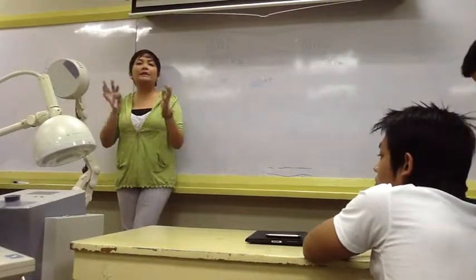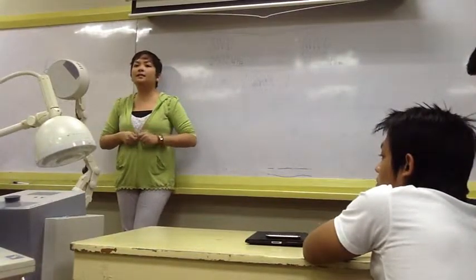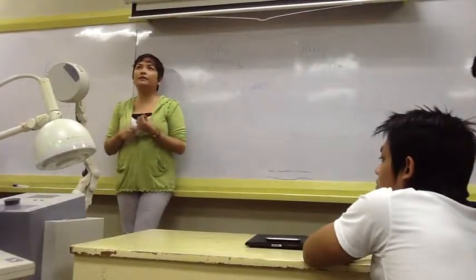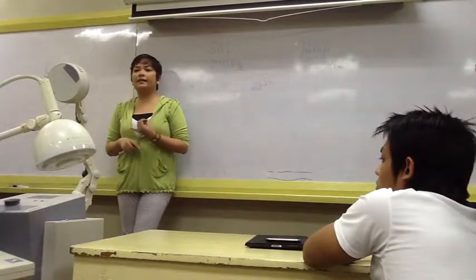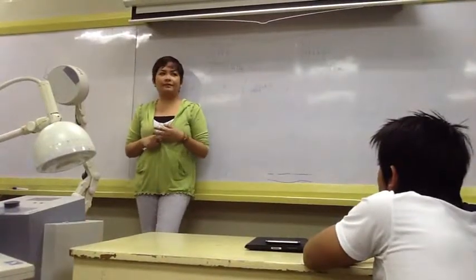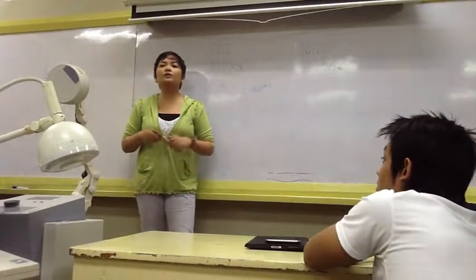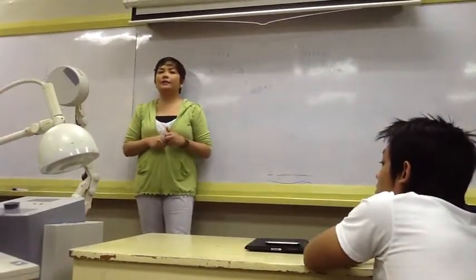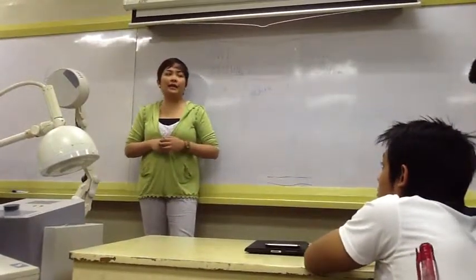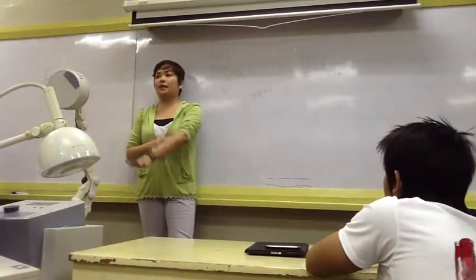But definitely, parehas lang sila ng effects. So ano ulit yung effects ng heating modalities natin? It promotes vasodilation. What are the benefits of vasodilation? Increased blood flow. What else? It improves the pain threshold, with increased metabolic activity. What else, aside from vasodilation? It decreases muscle tone, so it promotes muscle relaxation. All of those we can also achieve using our diathermy.